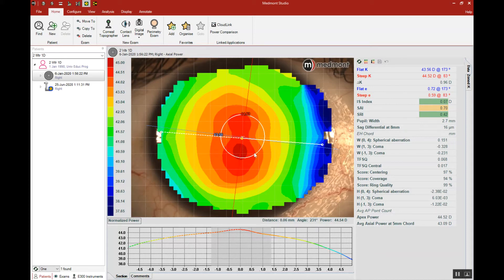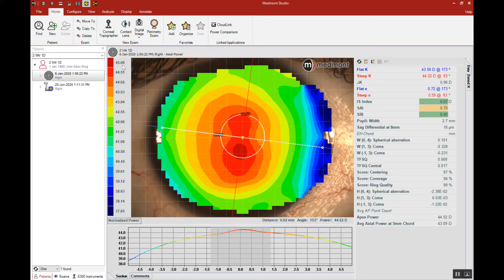Eccentricity can be very good at describing the normal corneal shape and this rate of flattening. It's good at describing the prolate eye. It cannot describe the oblate eye — the eye that's reverse in shape, flattest in the center and steepest toward the periphery. This prolate eye would be considered a very normal shape and very straightforward in terms of contact lens fitting. This patient should fit into virtually any conventional contact lens, soft or rigid lens construction.